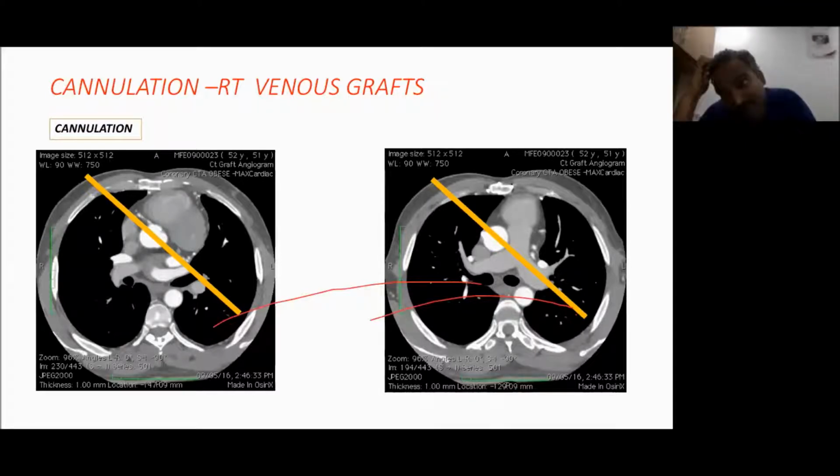See, you need a perfusion catheter. Mostly, you have to give it with a perfusion balloon. You get a good perfusion balloon from Atrium, but I think it's not available now. Or you can simply take a microcatheter. You put multiple holes on the microcatheter and then use that microcatheter to inject. So a microcatheter is a good choice if you don't have a perfusion balloon.